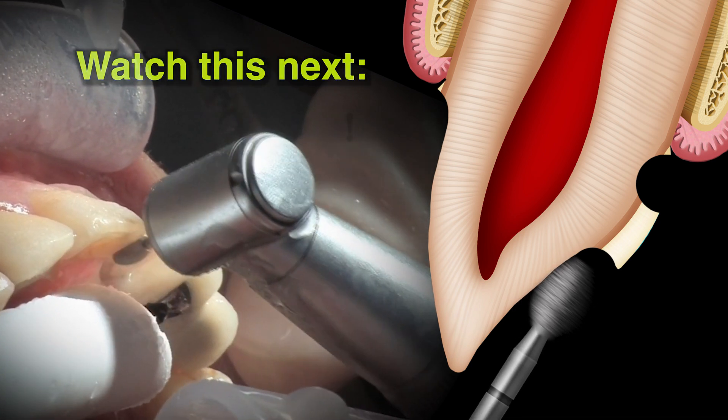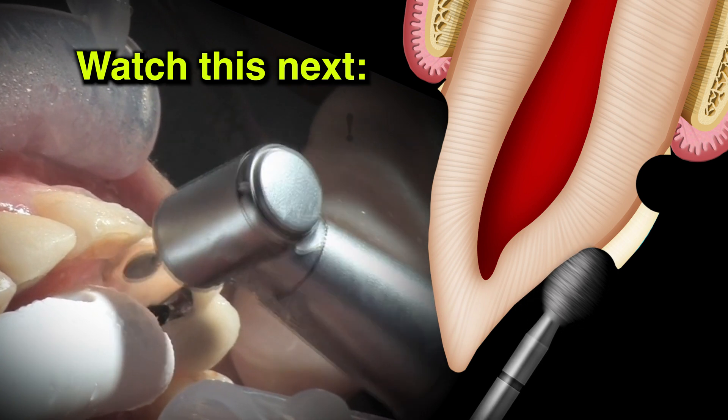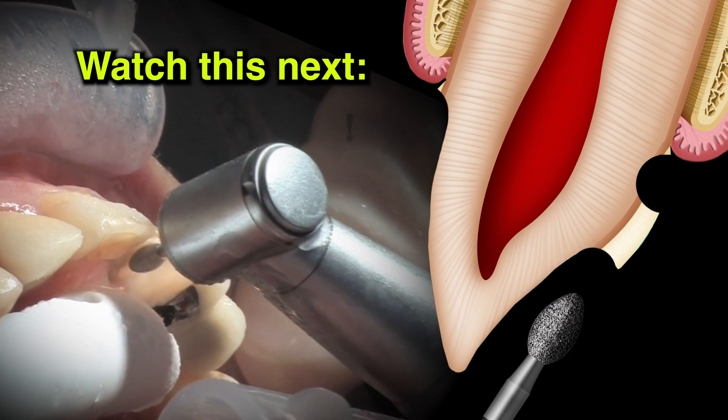Step seven is the lingual reduction. I'll usually mark this with a piece of articulating tape, and wherever that lower anterior tooth is hitting, if I'm doing zirconia, I'll put a six-tenths of a millimeter depth cut right through that blue mark.